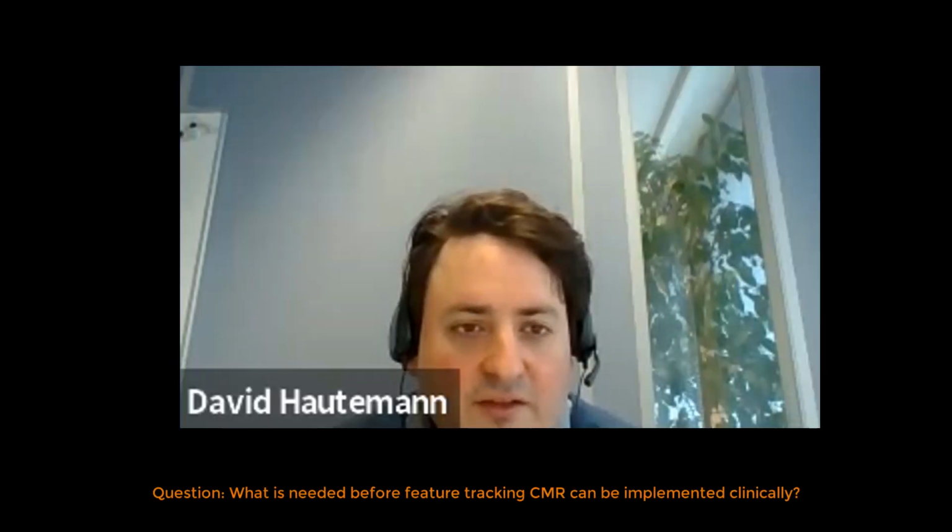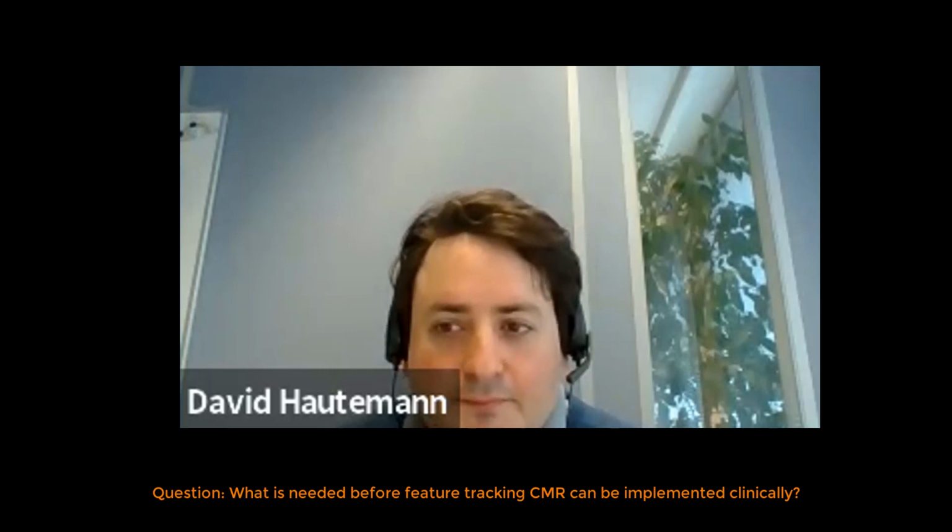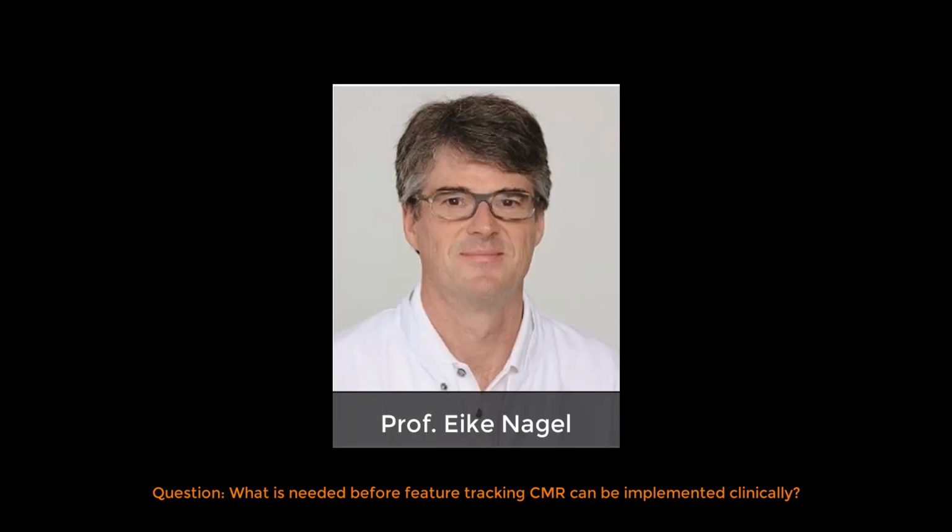Now, there was another interesting question. What would be needed before feature tracking CMR could be implemented clinically? I think we're there to use it clinically. We need more studies to compare it to ejection fraction and see if the feature tracking values are similar or superior. But the first larger scientific studies show that feature tracking actually is a better parameter to predict outcome. So I think we can start using it.